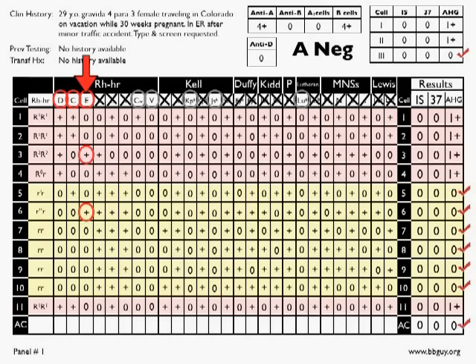And again, in the real world, you've got more work to do. There's no question about that. And let's talk about that in just a second. On an exam, you can make a presumptive identification of this as anti-big D and move along. So let's talk about the other stuff that we would have to do in the real world. The other stuff that we have to do includes potentially phenotyping.